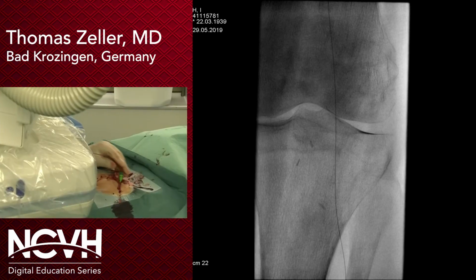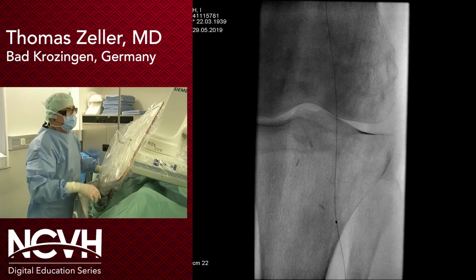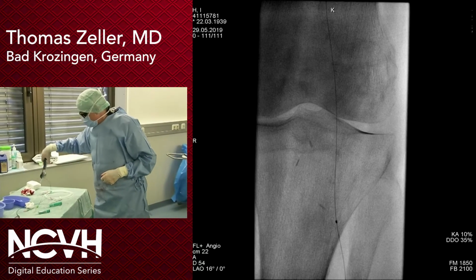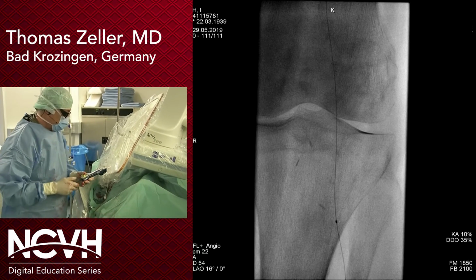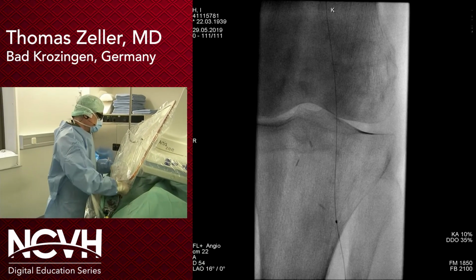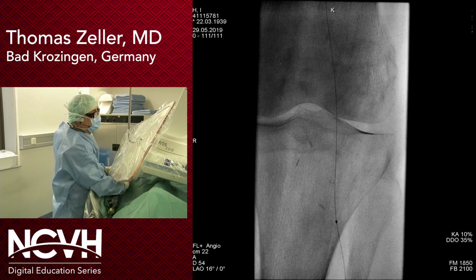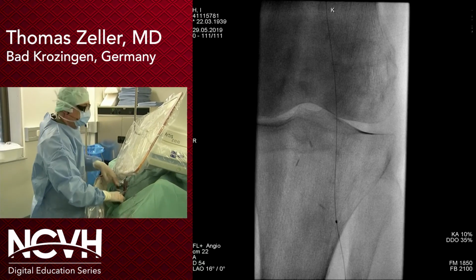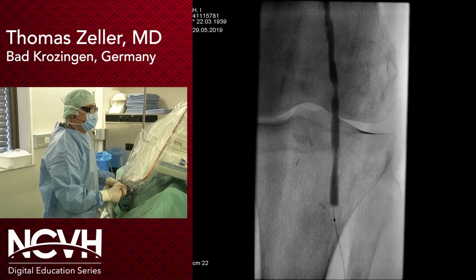Dr. Zeller, are you concerned about drug absorption at all without pre-dilatation here? Well, to be honest, it's an unknown. We don't know whether pre-dilatation does result in a better drug absorption to the vessel wall due to micro or macro fissures induced by pre-dilatation. It could be, it's not proven yet.